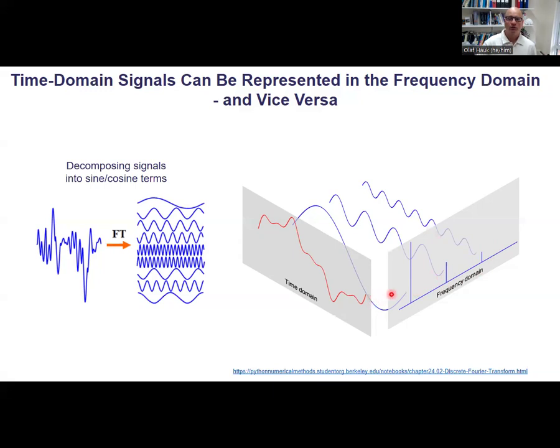And it looks like we are just making things more complicated, so we are turning one signal into many other signals. But the idea, of course, is that we can then say, okay, some of these signals are what we want, others are signals that we don't want, let's say high versus low frequency, so we can remove what we don't like, and we can reconstruct a cleaner signal in the time domain that we can then analyze further.